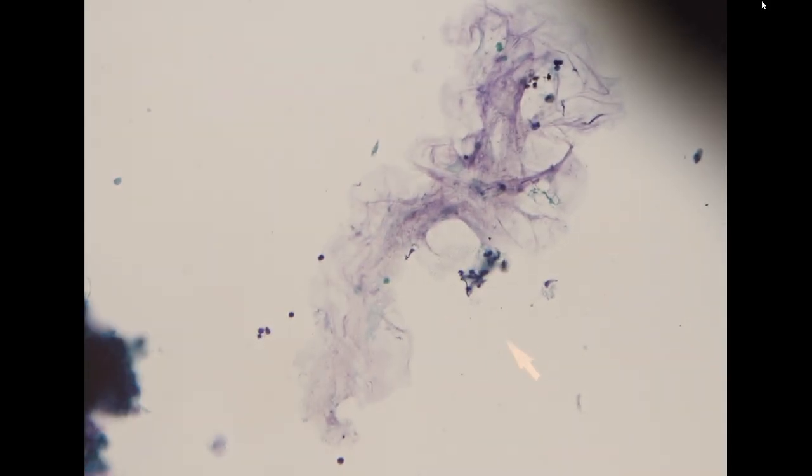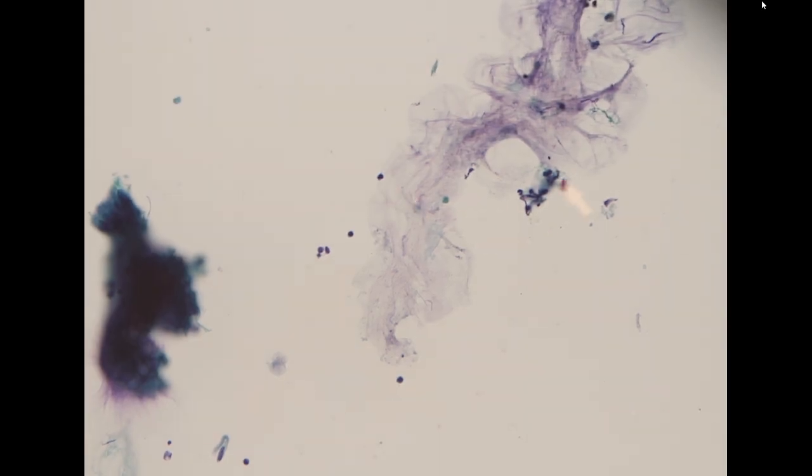In the background, we do see some mucin. In liquid-based cytology, if you see a little bit of mucin, it means there is a lot of mucin, and when you see something like this, it is less likely to be contamination from mucin in the intestinal tract. Then you see this cluster of cells. The cells show a small nucleus, but it's really three-dimensional.